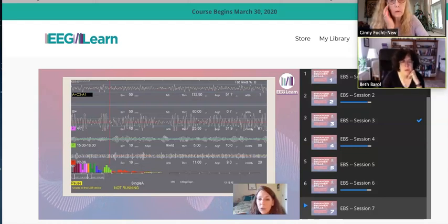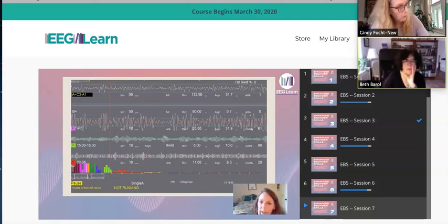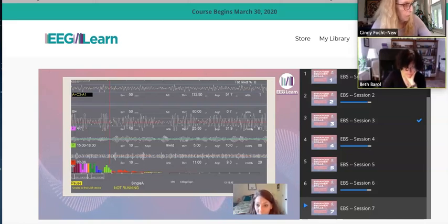So again, I always like to start with the reward threshold myself, because that's what the beep really hinges on. I'm going to treat that threshold like a floor, that I don't want that activity to fall below. I know you only need about 5 or 6 microvolts, so I just put that threshold at 5 microvolts. And you can see the higher percentage on the reward threshold means that it's easier, right?